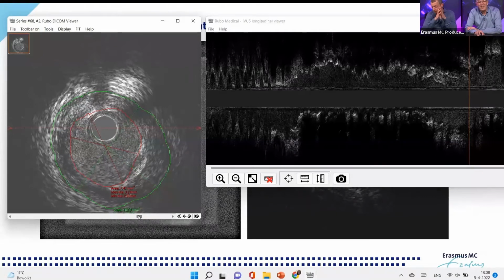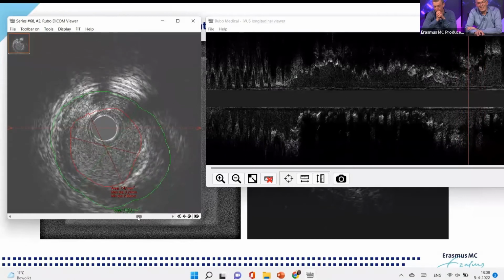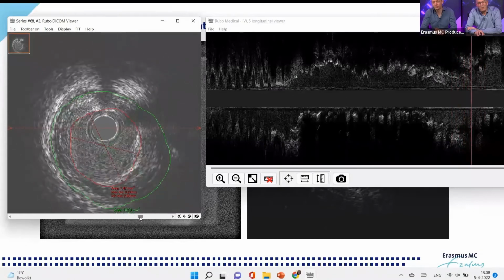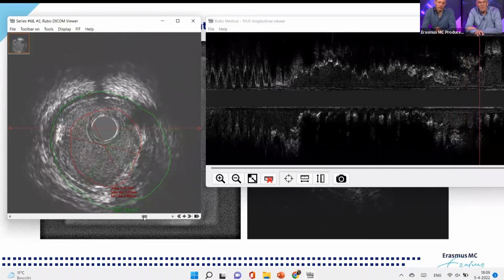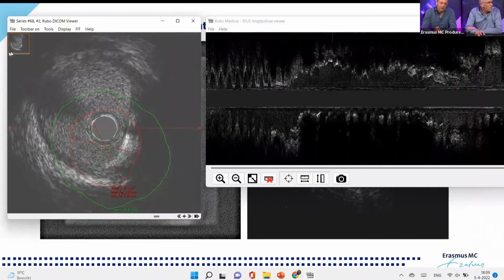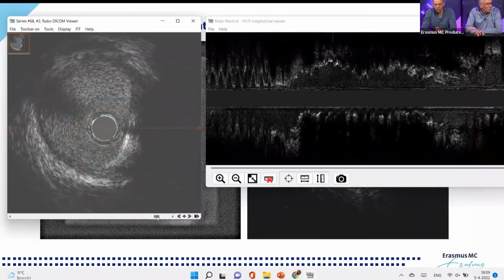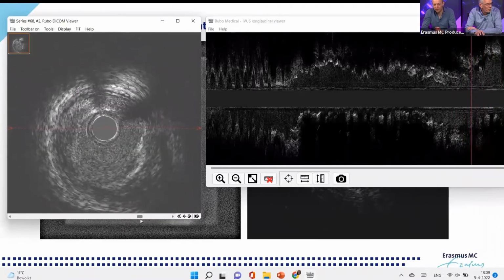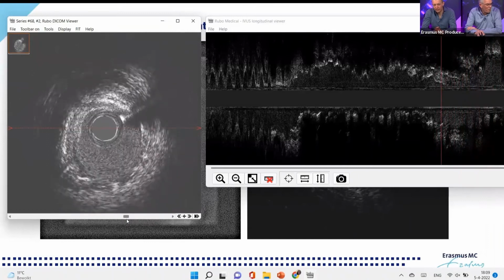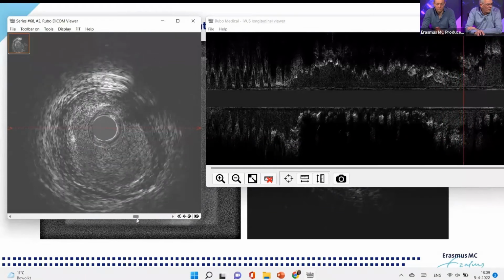I absolutely agree with that, Jurgen. I think there should be no intent to measure cap thickness on IVUS. The resolution of IVUS is simply insufficient to do so. But what you can do is to get a, let's say, global understanding of the type of the plaque. Is that lipidic? Is that fibrotic? Or is that calcium? And in case it's fibrotic or calcified, I think you are relatively on the safe side. But if it's lipidic, like in this case, in which it's a bit of mixed plaque, you might have a higher likelihood of dissections and future problems.